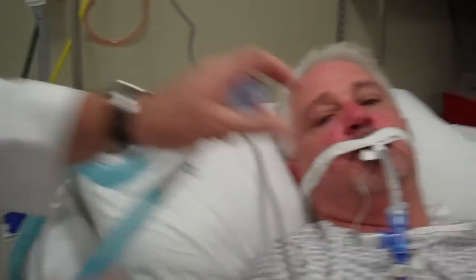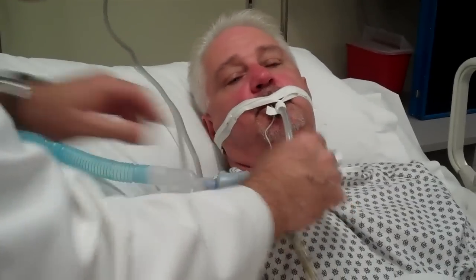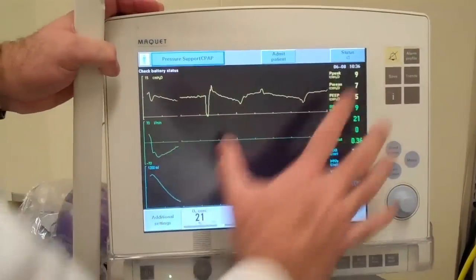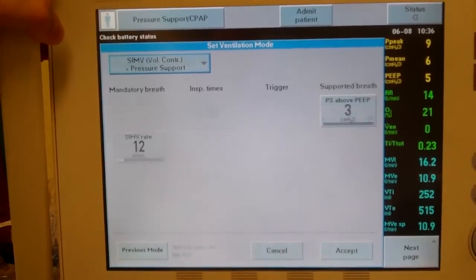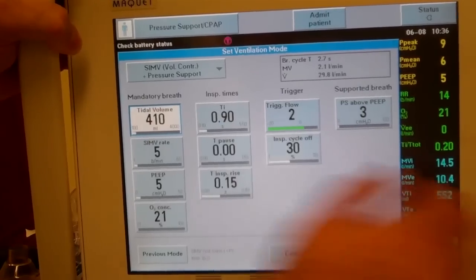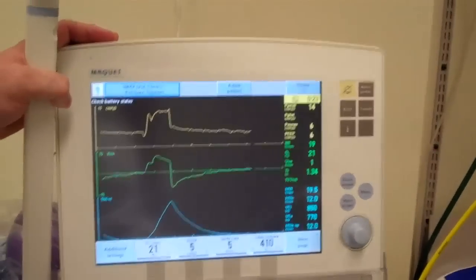Now what we're going to do is disconnect him from the ventilator, because it takes a little time and I don't want him to be subjected to all that work. Put him back on the acceptable trigger and then reconnect his ventilator and verify that he's on the proper settings he's supposed to be on. He's in the CPAP mode here. When you get finished with these tests, you always have to make sure that you go back and put them in the proper tidal volume and where they're supposed to be on the ventilator — back to their previous settings.